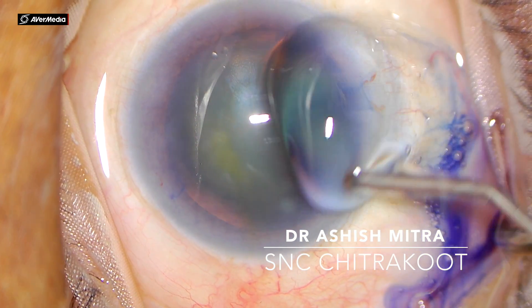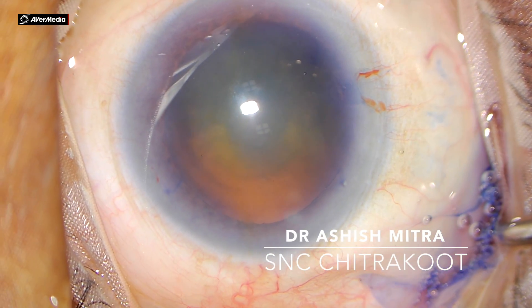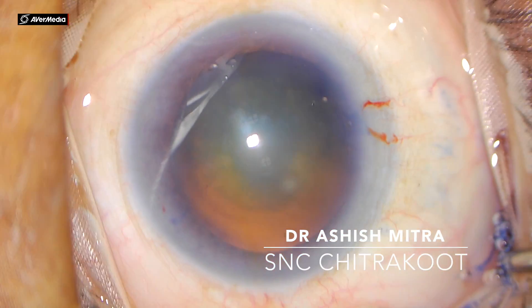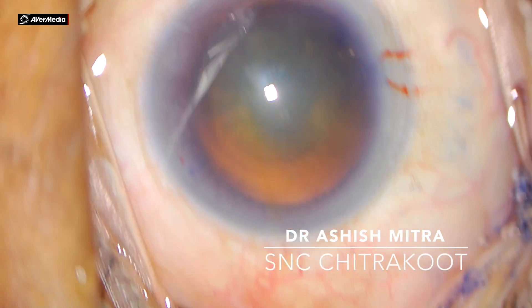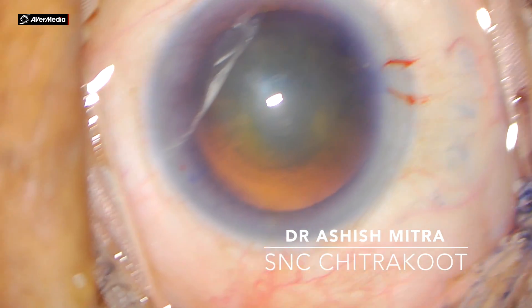After that, visco is injected to remove the air bubble and excess dye. You should put visco on the cornea as and when required, as this will prevent drying of the cornea. After that, if required, you might need to focus the eye again so that your view is clear and crystal.